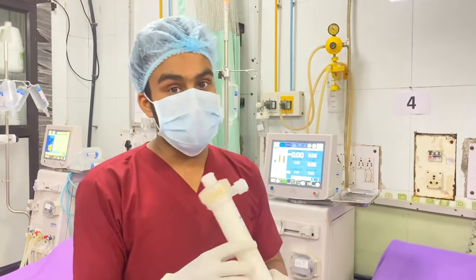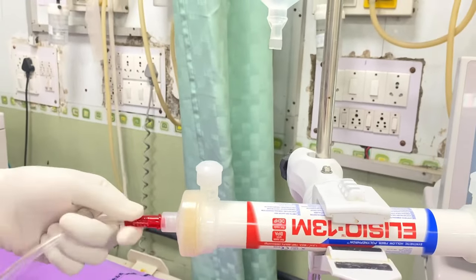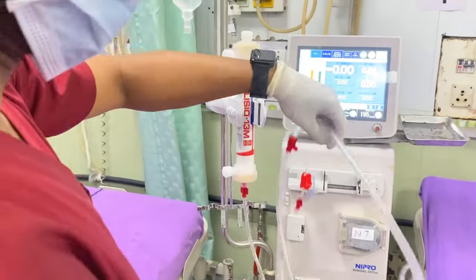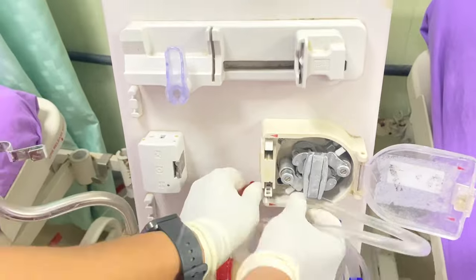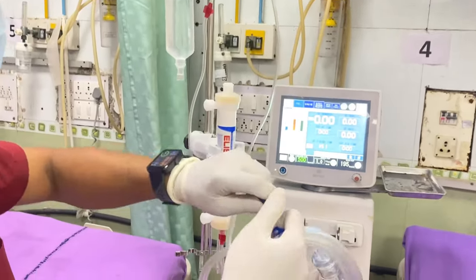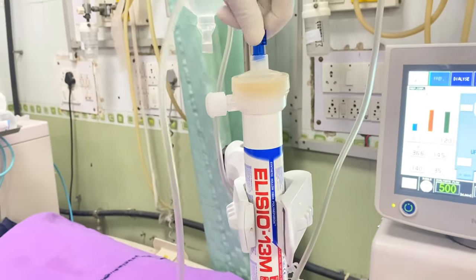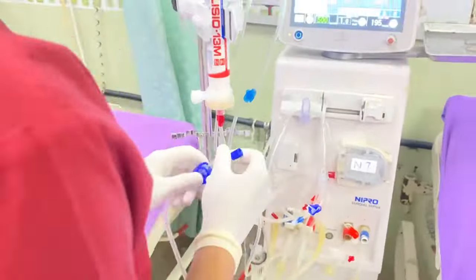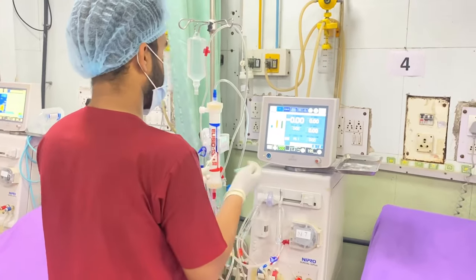This dialyser has a surface area of 1.3 meter square. This is the artery line which has to connect to the blood inlet part of the dialyser, and this is the blood pump segment which has to be fixed in the blood pump. And this is the venous line — we have to connect it to the outlet of the dialyser. Always try to prime the dialyser in the anti-gravity direction so all air bubbles are removed during priming. This is the IV set — we have to connect it to the artery line of the AV blood tubing.